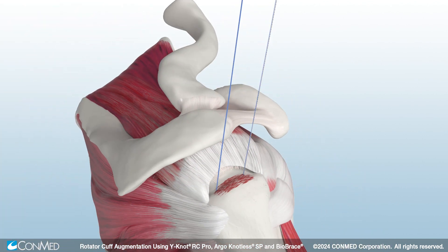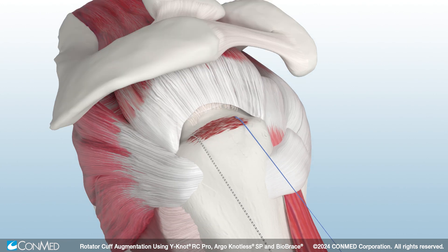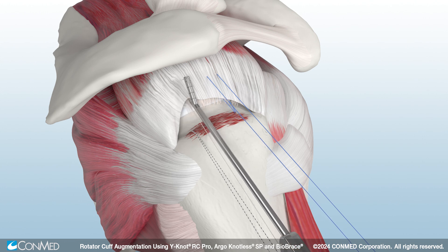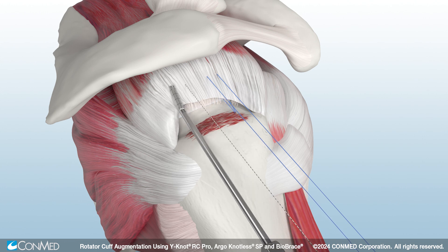Remove one suture from each anchor and retrieve the sutures to prepare for suture passing. Use a suture passer to pass the remaining suture limbs from each anchor through the rotator cuff. These sutures will be used to shuttle and fixate Biobrace medially.